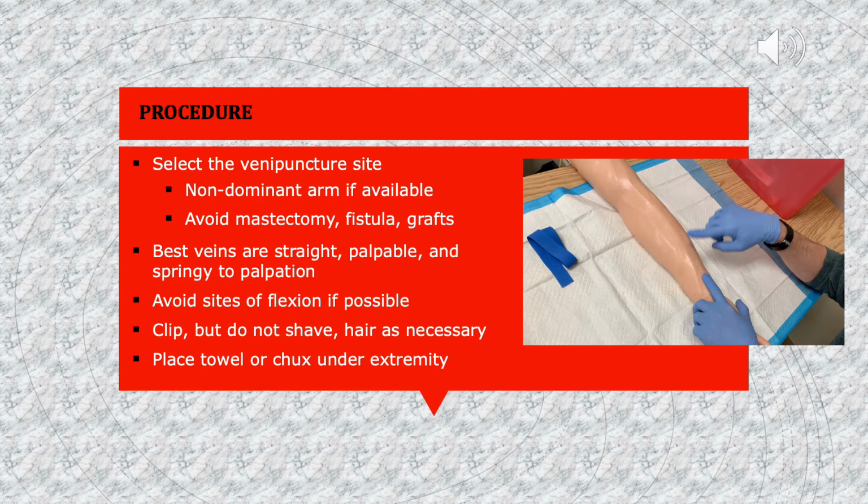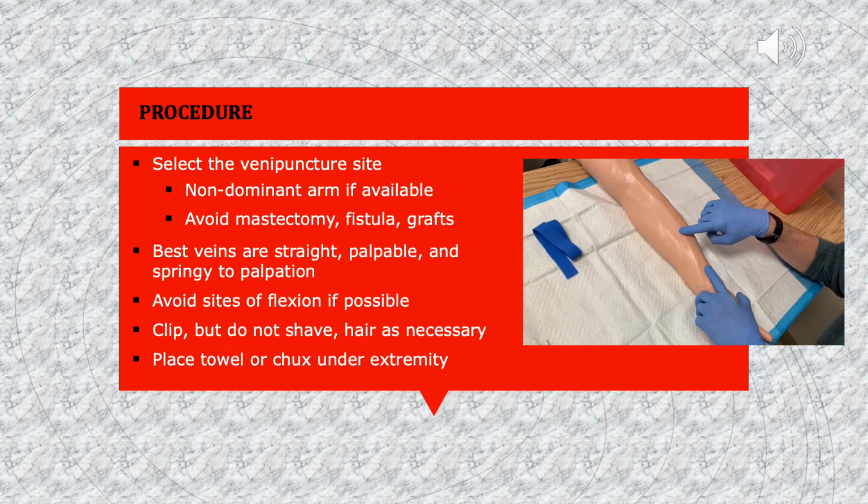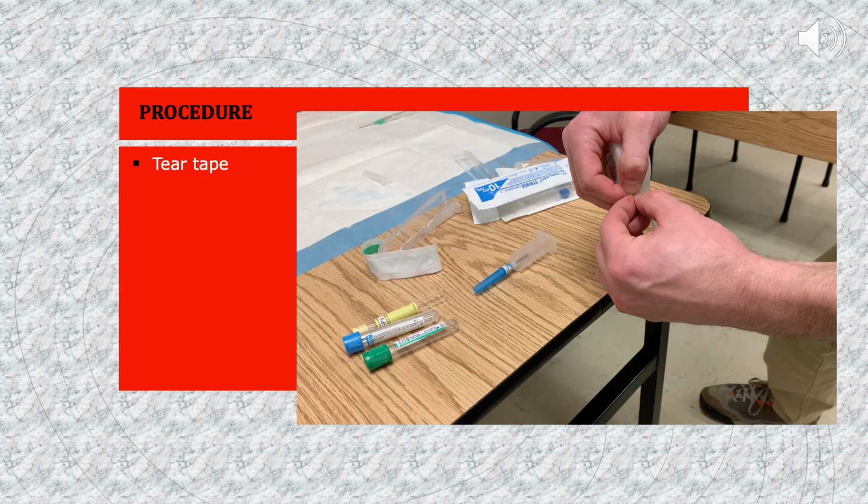Remove hair with clippers, but do not shave the venipuncture area. Place a towel or Chuck's pad under the extremity to be used to protect the patient from blood and other spills. It may help to place the patient's arm in a dependent position, that is, lower than the heart, to help dilate the vein. Tear some extra pieces of tape if desired.